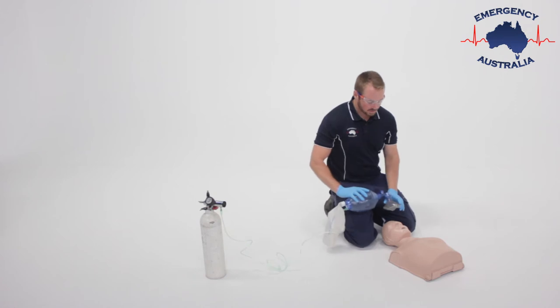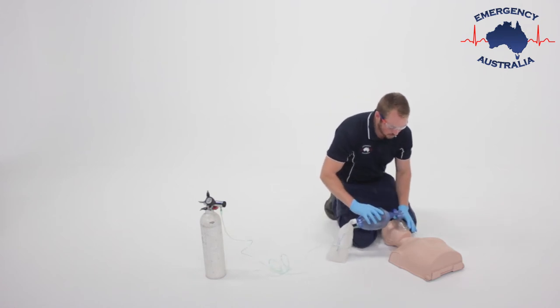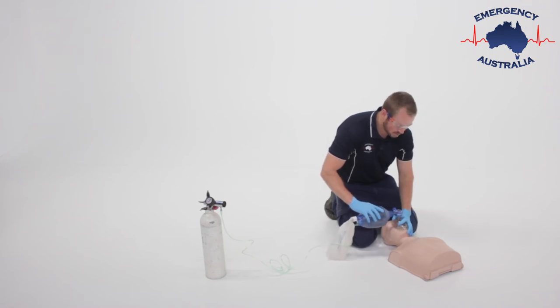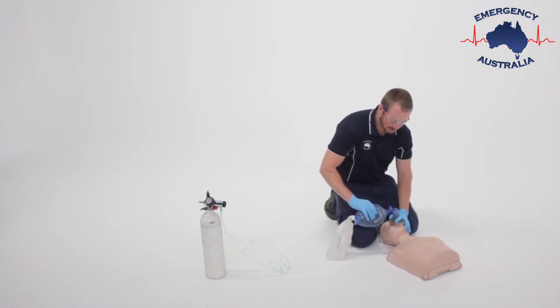Placing the mask over the patient's nose and mouth, we form a C over the top and an E underneath the jaw, tilting the head back and ventilating the patient.